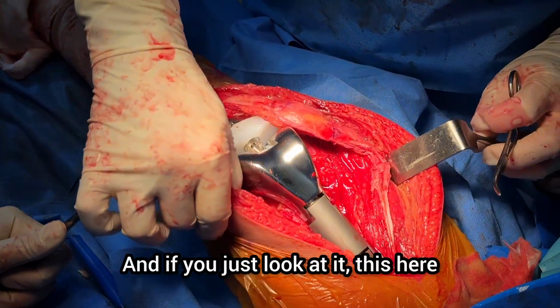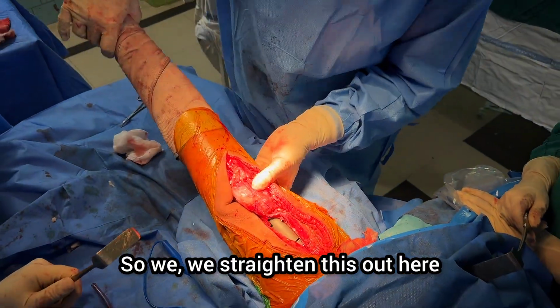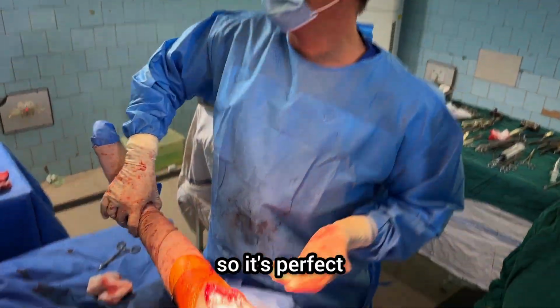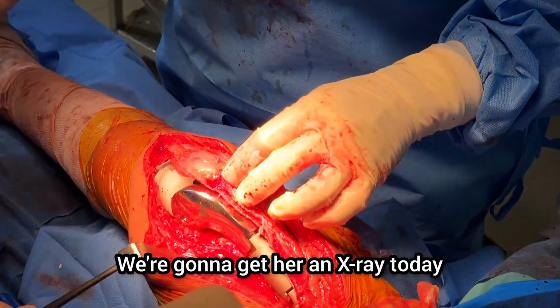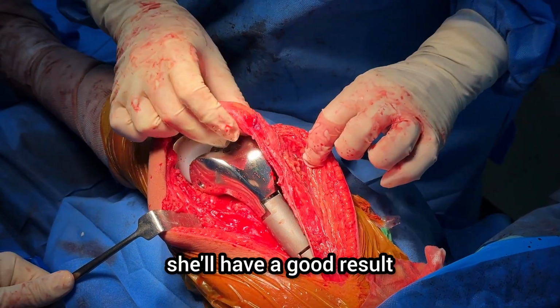If you just look at this here, this really does look beautiful at the moment. If you straighten this out, it's full, nice and solid, and patella tracking is gorgeous there as well. So it's perfect. I think that covers it. We're going to seal this up very nicely. We're going to get her an X-ray today, do some blood tests in the morning. We're going to get her fully weight bearing on this, and inshallah she'll have a good result.